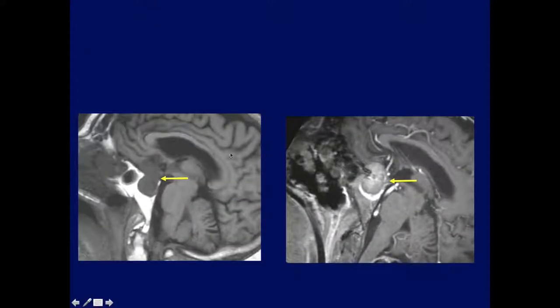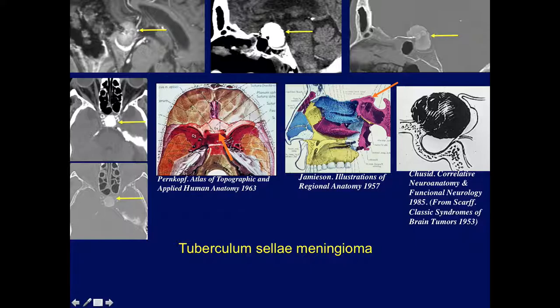Here's another tuberculum sellae meningioma actually filling the entire pituitary fossa. A CT here would be advisable — notice it's totally calcified even though it enhances a little bit. On CT this is a markedly calcified tuberculum sellae meningioma hanging way down, filling the entire fossa, starting in the region of the tuberculum sellae.